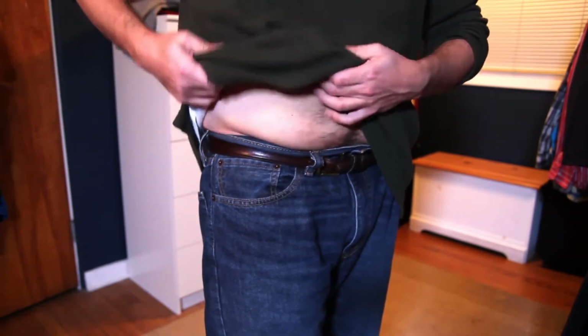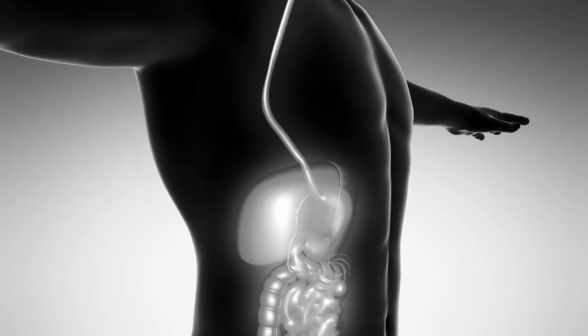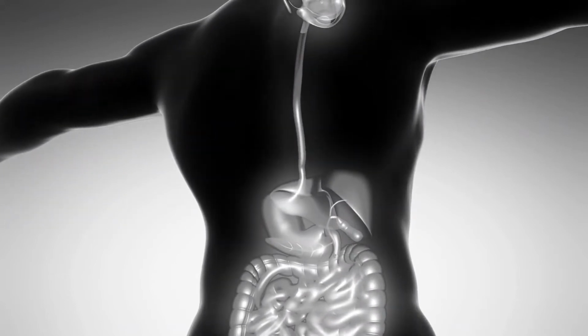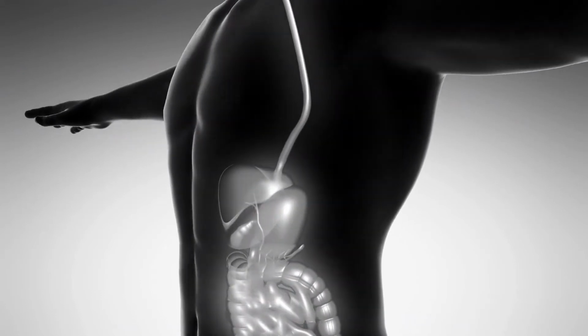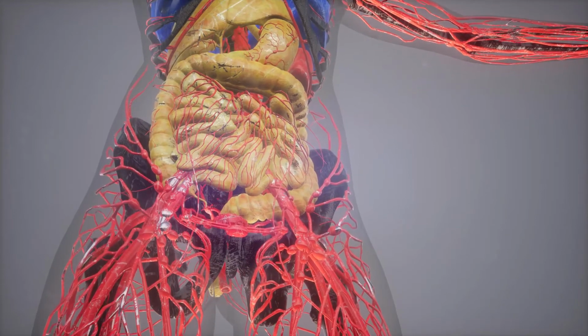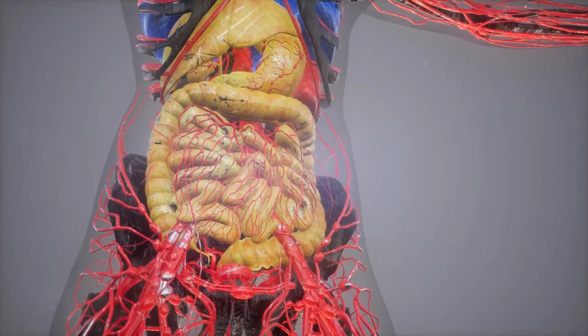Like an EGD, a bronchoscope is threaded through a person's mouth and throat. The bronchoscope goes into a person's trachea, not the esophagus, though, and is used to examine the airway and lungs. If a doctor needs to look at the upper airways, the scope may be threaded through the nose. During a bronchoscopy, a doctor may also take samples of the lungs for testing. A patient may undergo a bronchoscopy to wash the airways and lungs, which is known as lavage.